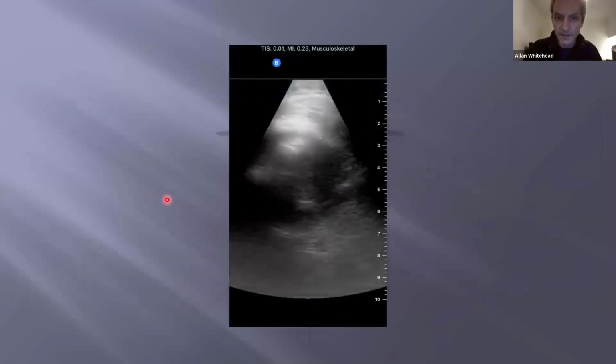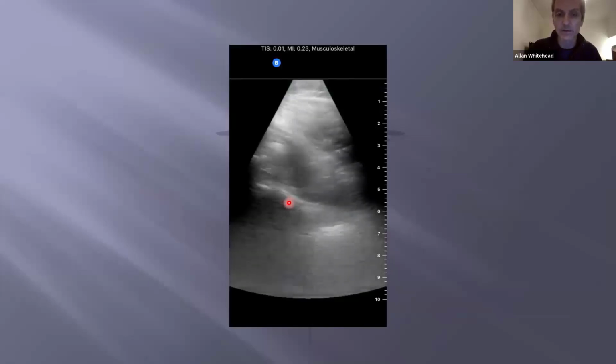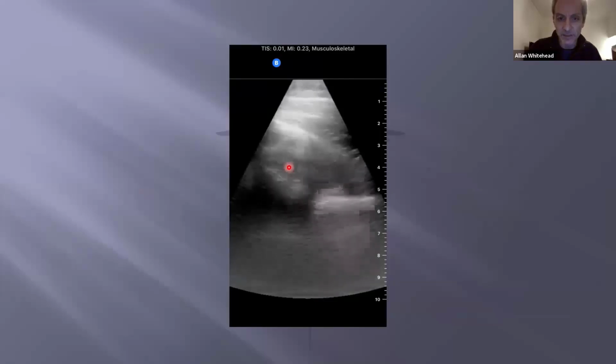Okay, a clip here, and I'm having a bit of trouble myself actually identifying the glenoid initially, but as we wait a bit, it'll come a bit clearer.